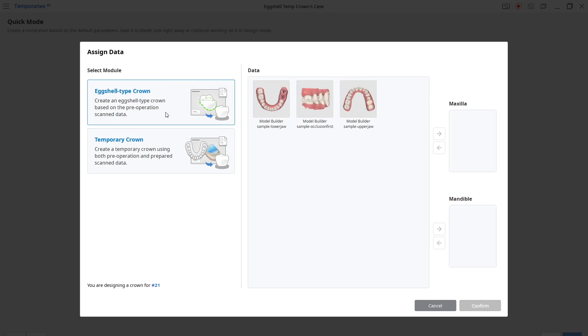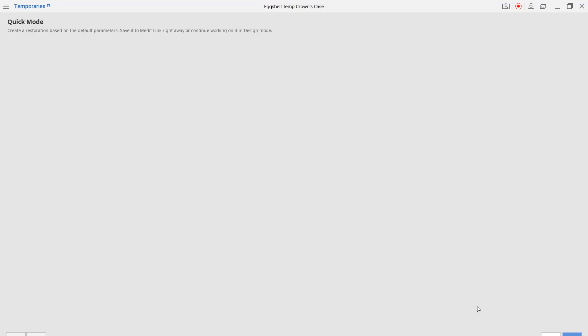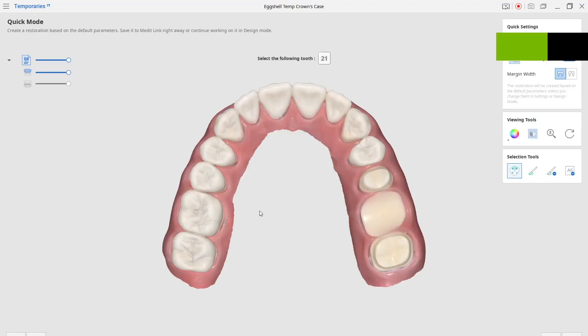Now once it launches up, you can see we can choose eggshell crown, where it uses an existing tooth and shrinks it down and makes an eggshell crown — which is what we're going to do here — or a temporary crown based on a pre-op scan.